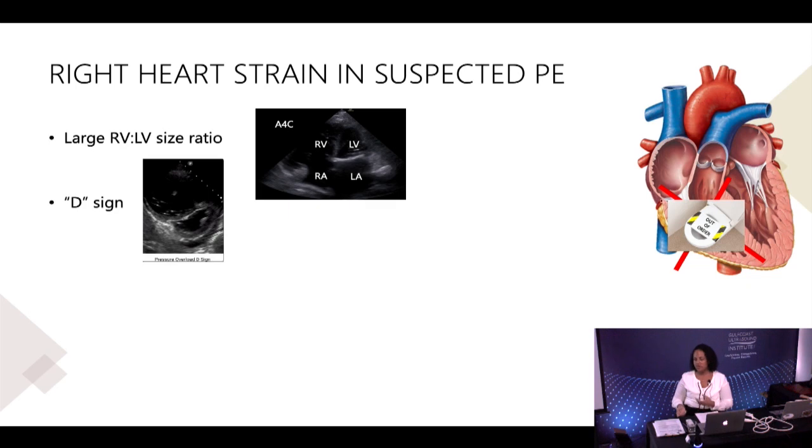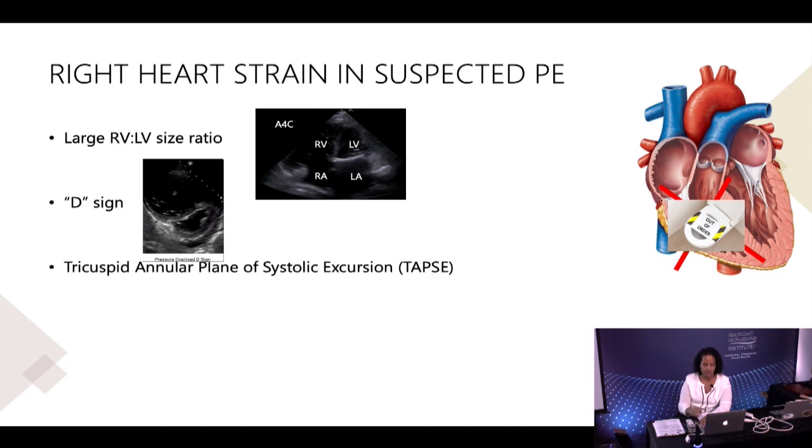And then just to give you a little bit about sensitivity and specificity, this sign unfortunately is non-specific for PE. However, it gives you another reason to think there's right heart strain, obviously, and in the right clinical setting, this could probably rule in PE, and you could continue with the next step in terms of doing the confirmatory study/treatment for it.